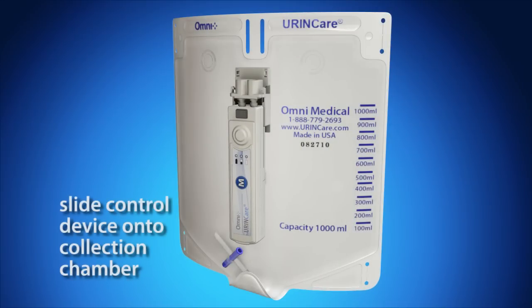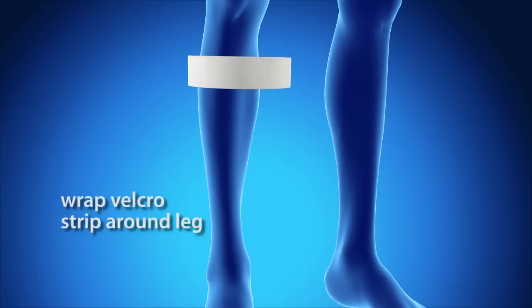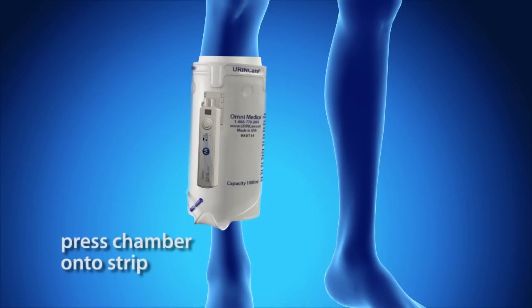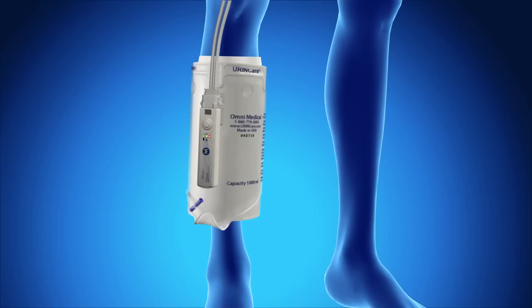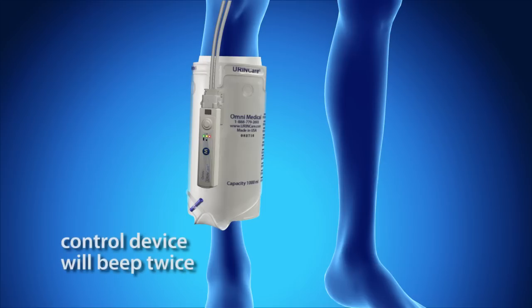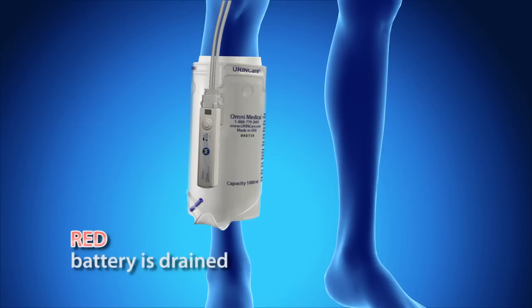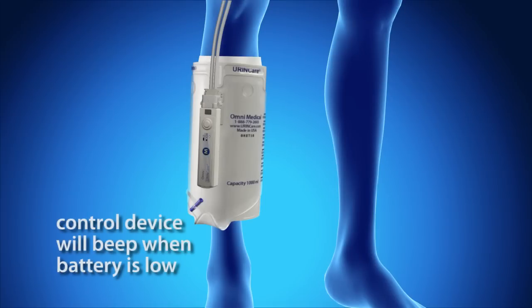Slide the control device onto the bottom of the collection chamber clip. There will be an audible click when the connection is complete. To attach the collection chamber to the leg, first put on the velcro strip by wrapping it around the leg at the preferred height. Once the strip is secure, simply press the collection chamber onto the strip and fasten with the lower straps if desired. Ensure that the collection chamber T-valve is closed before use. Attach the hose connector to the collection chamber clip. Upon connection, the control device will beep twice and all battery status indicator lights will flash. The flashing lights indicate whether the unit is fully charged, partially charged, or completely drained. Consult the manual for the full battery indication chart. The control device will emit an audible beep when the battery needs to be changed.